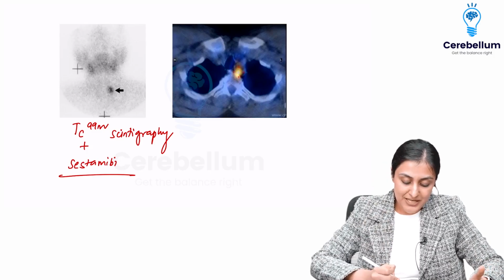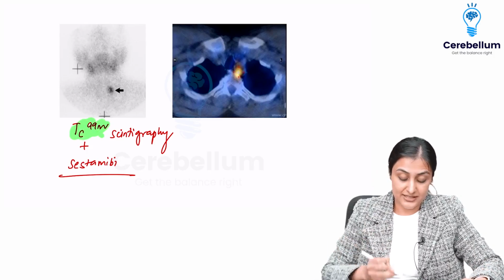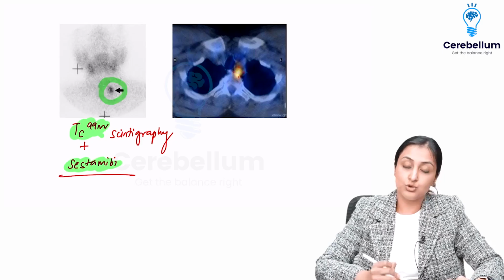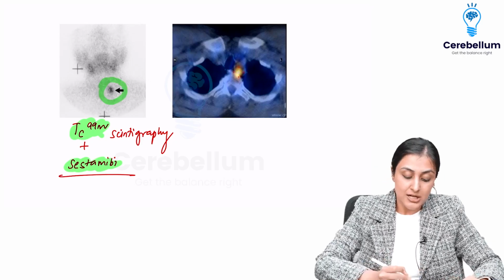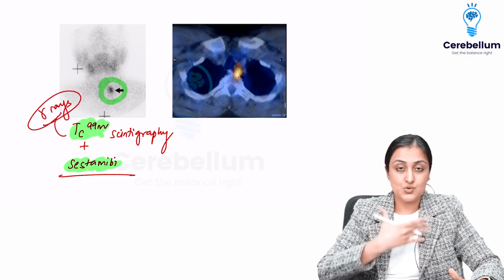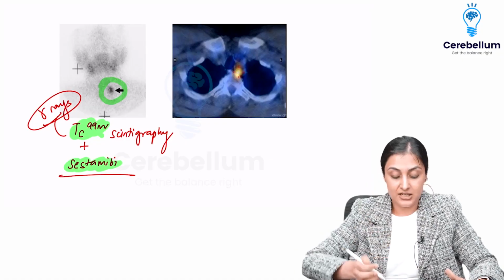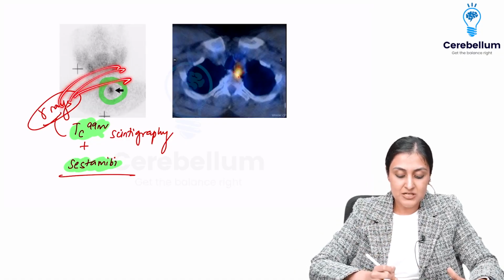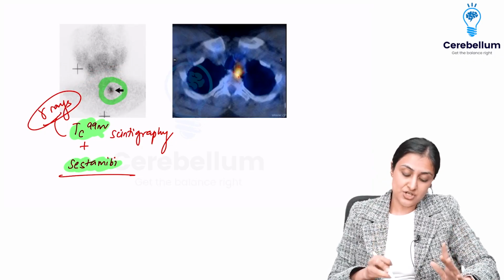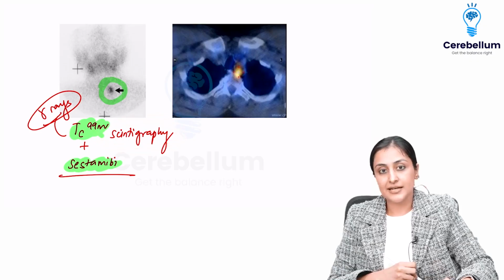My technetium has been clubbed with it, so technetium also tags along. Wherever there is parathyroid adenoma, both of these are going to bind to it, and the technetium is then going to emit gamma rays. So that is what my gamma camera will detect. If there are gamma rays being emitted here, they will be detected as this hotspot. So such a study is called a scintigraphy study.